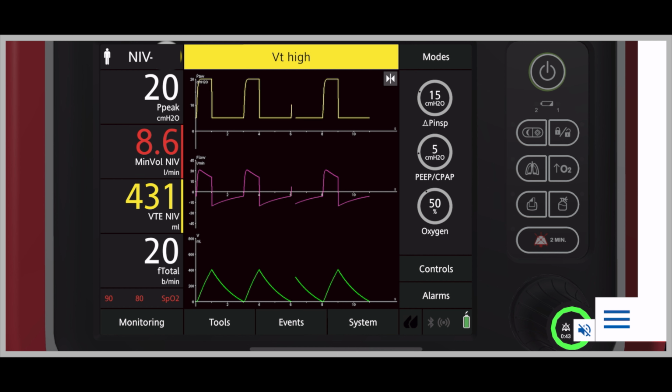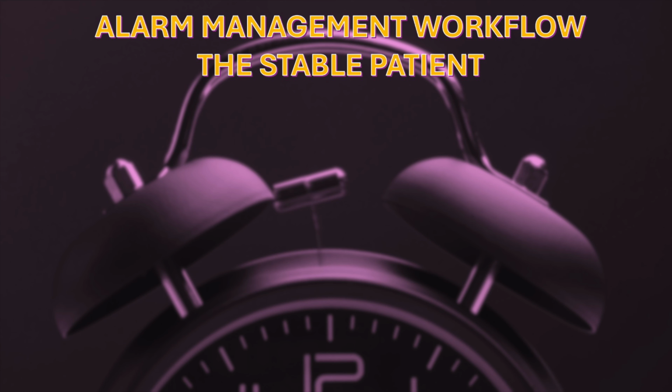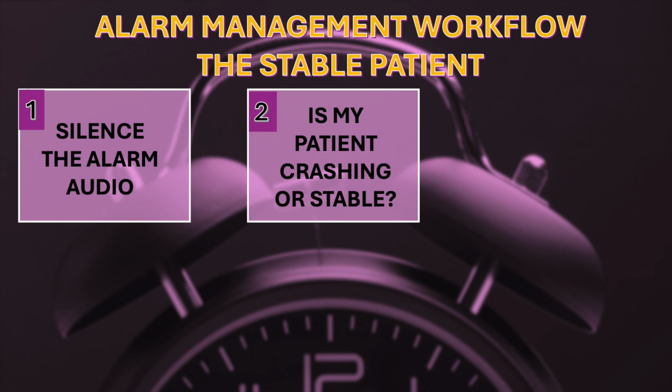Oh my goodness, the horror. Of course, you don't get tense because you know exactly what to do. You simply follow the alarm management workflow. So step 1, silence the alarm audio. And step 2, ask yourself a crucial question. Is my patient crashing or stable?